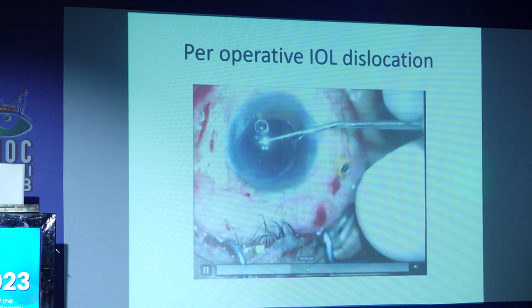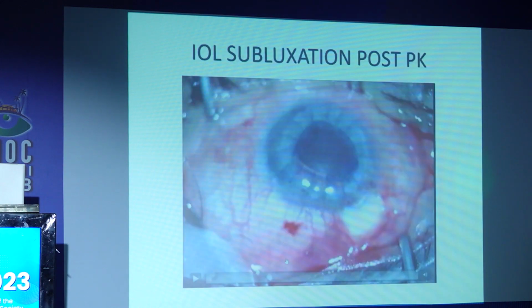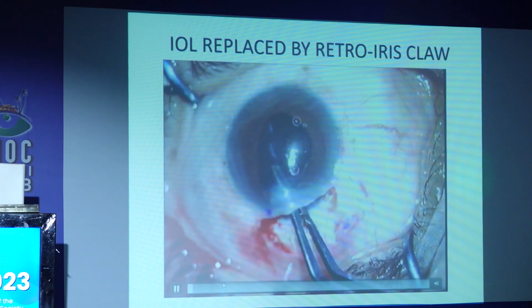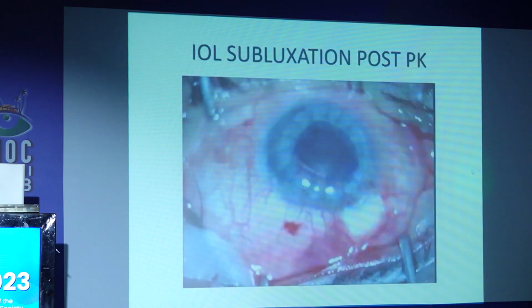You see, again dialing the other and just tapping, and then I come to know that the IOL is in place. This was again a post-PK IOL subluxation. So again, without removing the IOL out, sorry, this is the post PK.